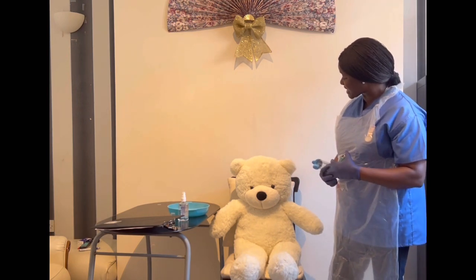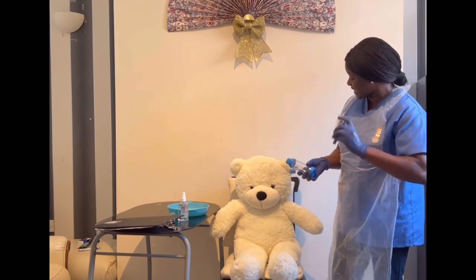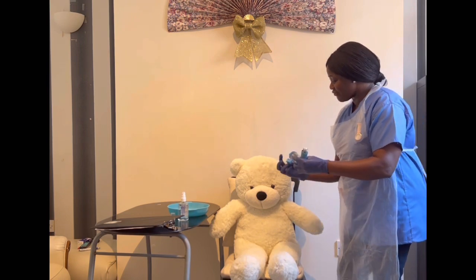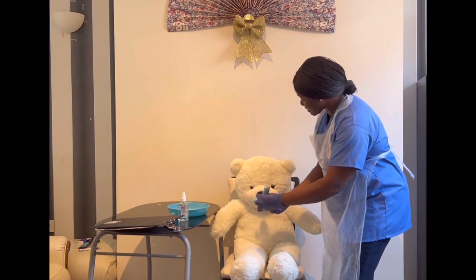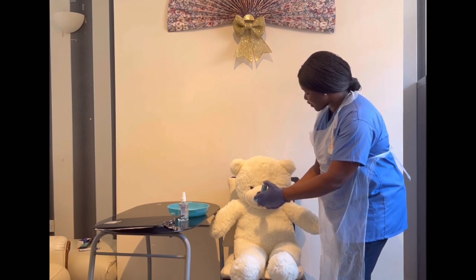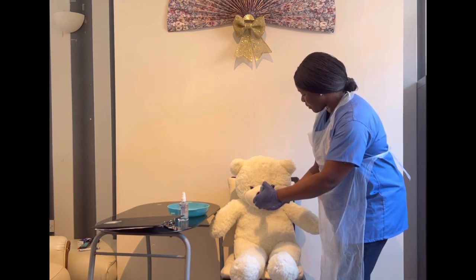Harry, are you ready for the second puff? Yes, nurse. Okay, can you breathe out completely again? Okay, I've shaken your inhaler. I'm fixing it. Can you form a tight seal with your lips, Harry, without biting the mouthpiece? Can you begin to breathe in slowly for 2 to 3 seconds? Are you ready? And I'm going to depress the canister for the second puff.